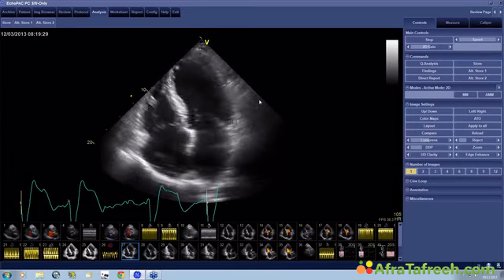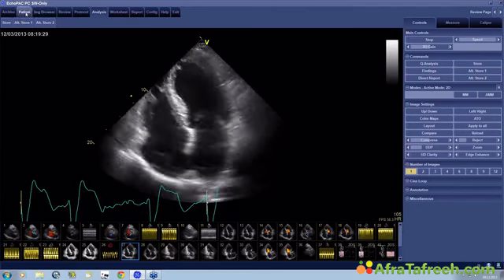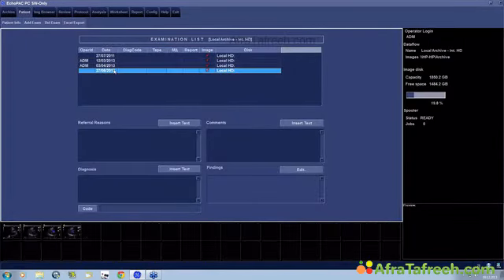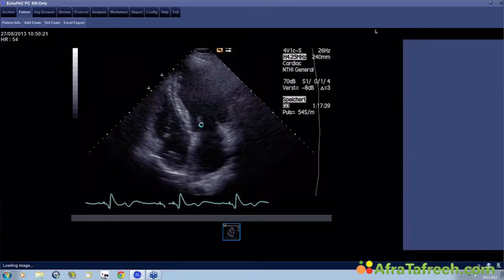So if you see this, it's a must. You must simply perform CRT, especially if the patients are symptomatic. And I'll show you what came out of CRT therapy in this patient, because it's so impressive to see what this therapy is capable of doing. Now, this is a follow-up study. I think 6 months later, I think 4 months after he got his CRT.